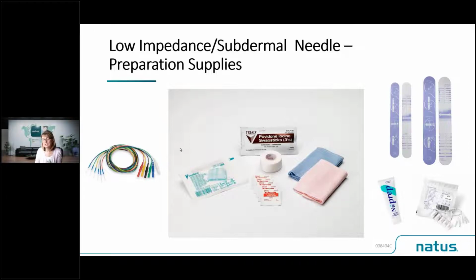So with needle electrodes, we're clearly now going to need something to clean the skin. So in this case, you can use, again, whatever it is that your local facility advocates for skin cleansing. It could be alcohol, it could be iodine. You know, generally people will use whatever it is that you use to prepare for an IV insertion. So get your cleansing agents ready, get your low impedance needles ready, something to secure the electrodes, some tape. Some people will use Tegaderm. I'll give you another couple of tips as we go through.